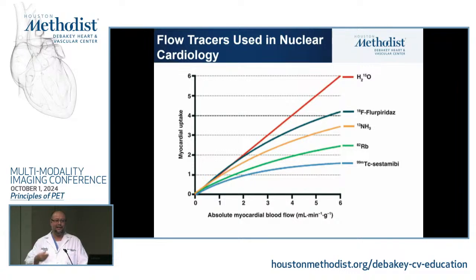So when you inject it, it just goes in the blood. It goes inside the cell, washes in, and washes out. You're just injecting radiolabeled water. It's purely water, but the O, instead of being 16, if you remember your periodic table, is now 15. So it is a different isotope of oxygen. When you inject water, its extraction is 100%. It's linear. What does that mean?